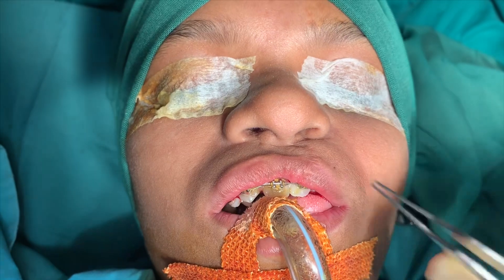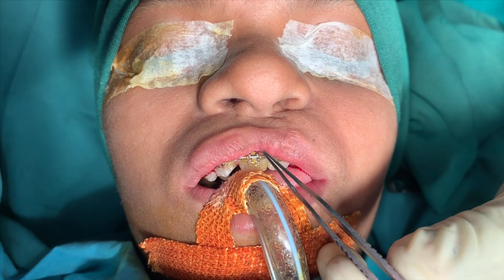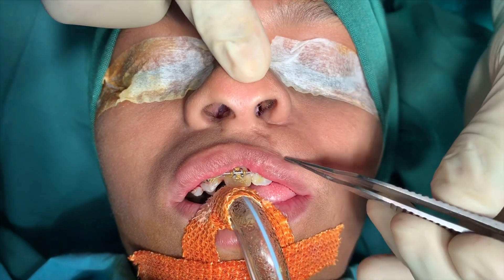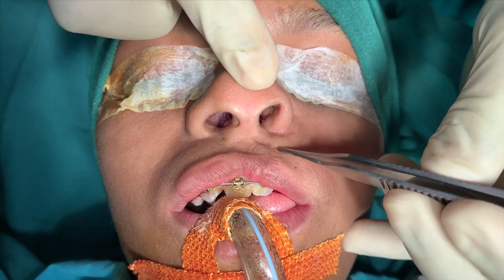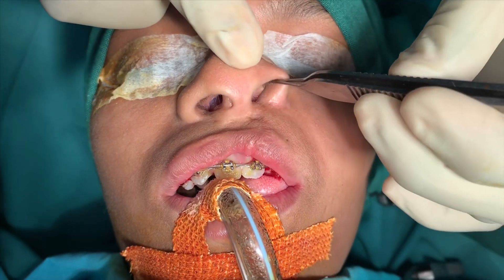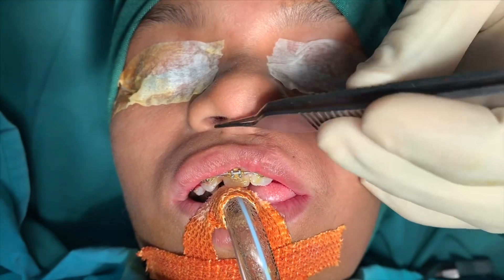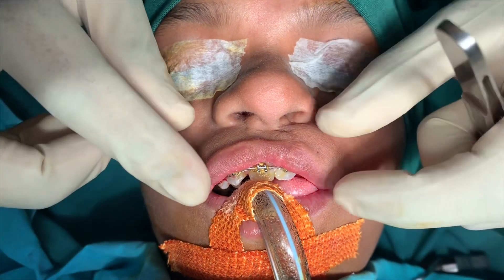That's the tubercle area, so this is going to come out a bit. All this scar we are going to take off, as much as possible. Some of these may be difficult to remove, but the rest we could improve a lot.